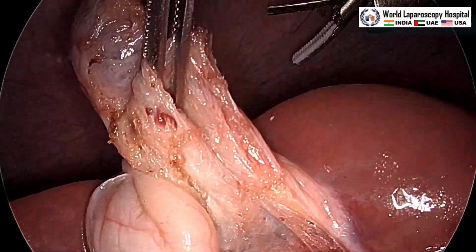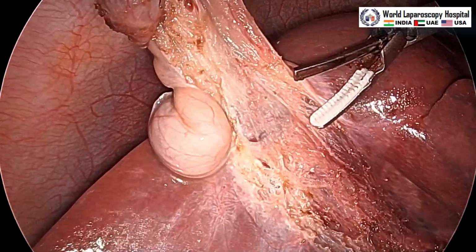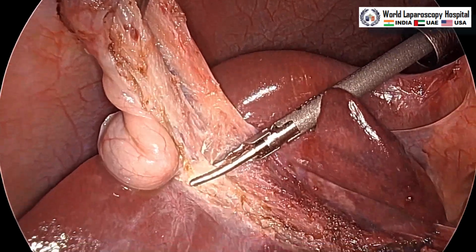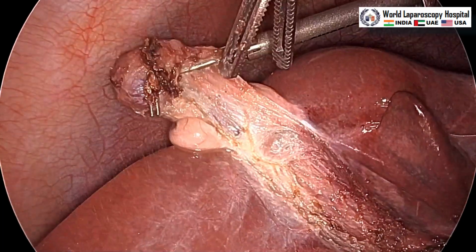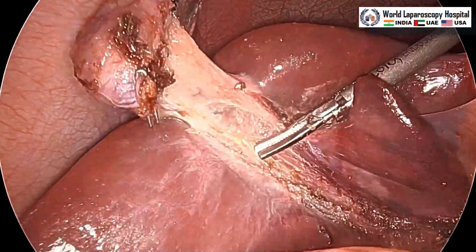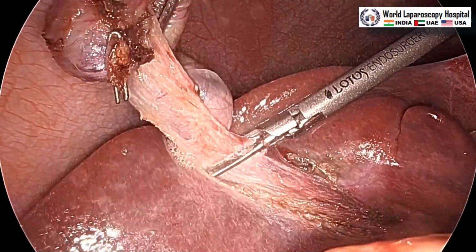So, now the fundus grasper has been removed, and then we will optimize the traction by holding the gallbladder a little more nearer to the liver, so that a good areolar plane is achieved. Generally, we keep the Teflon jaw of the harmonic towards the gallbladder so that it does not puncture. Sometimes blunt dissection also can give you a good plane, and you can separate keeping areolar tissue in the plane.